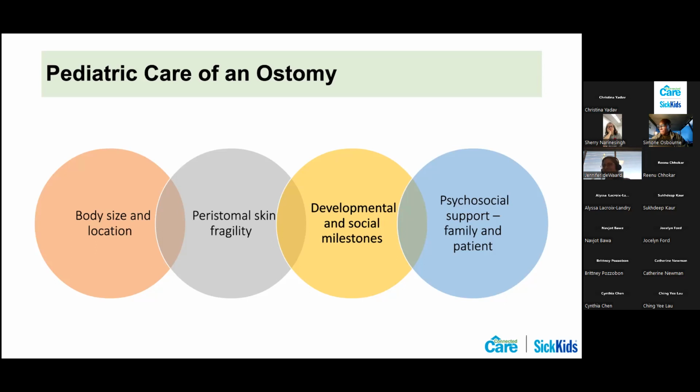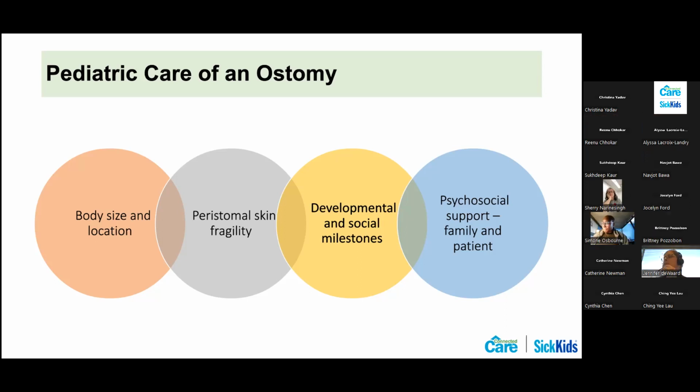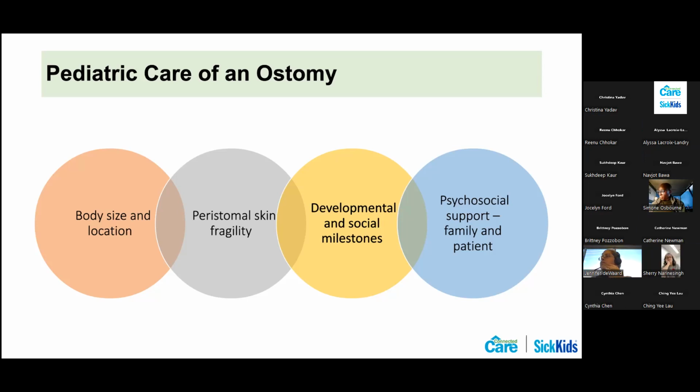In terms of the peristomal skin fragility, you can kind of look at it similar to older adults and seniors. We look at things like reducing skin injury with removal of the adhesives. We're putting products on the patients. What are the considerations that we have to think about in reducing that skin injury? How can we think about the products that we're using and ensure that they're not toxic for the patient? So, for example, some of our premature infants, a lot of these things are not tested on these age groups. So we do have to be mindful about what we're putting on the skin and whether it'll be toxic and absorbed in a specific way that could be harmful to them.